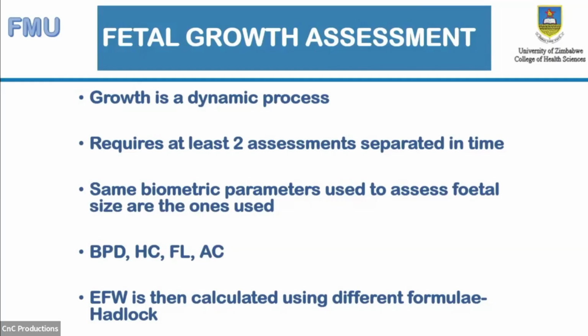Then the same biometric parameters used to assess the fetal size have to be used consistently. Dr. Verga talked about standardization. It's very important to standardize things at a personal level, because when you scan the same patient, probably within the same appointment, you can get different figures which can actually change the whole configuration.